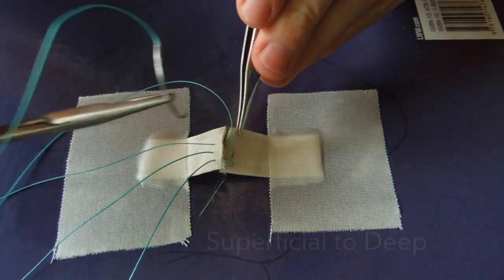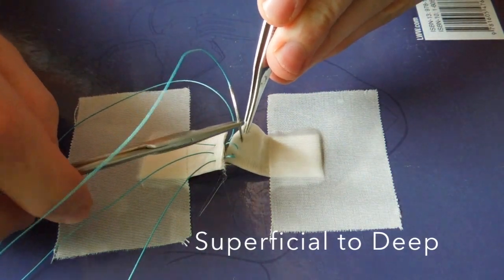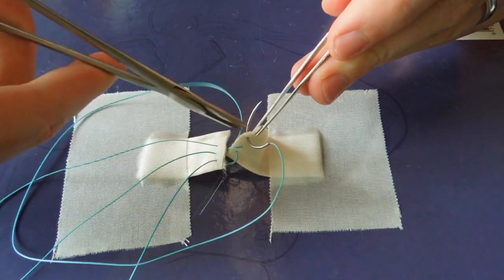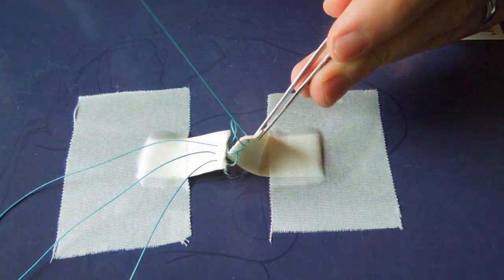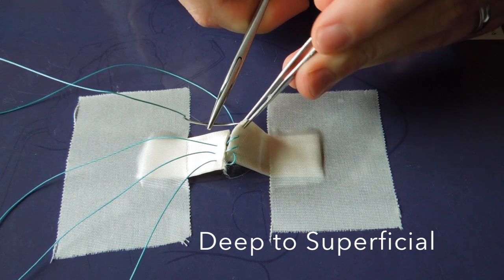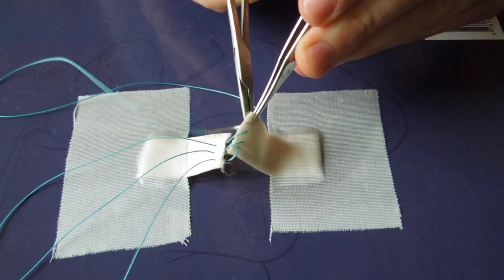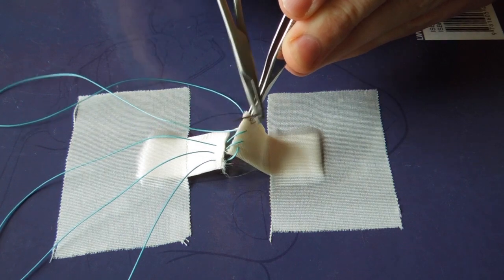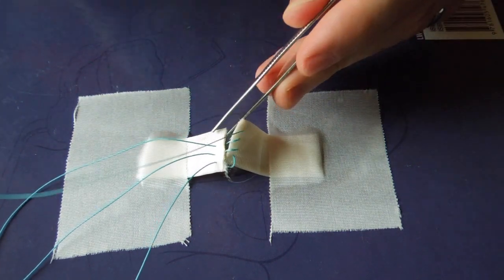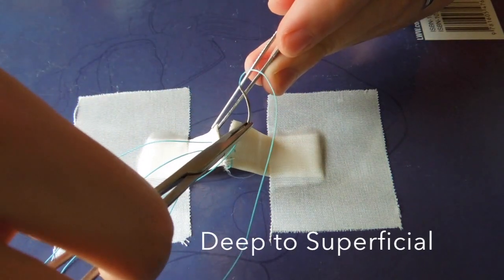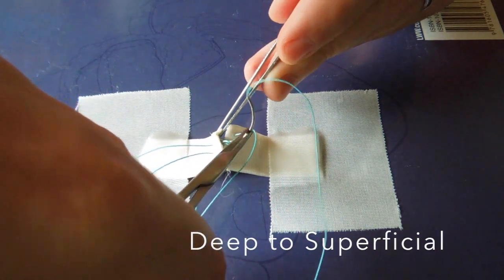Now if we're doing this repair for something like a plantar plate or an ATFL, when we throw these, if we tie the first throw, that will give us poor visualization for the second throws. So what we would do is we would throw each individual suture and then wait until the end so we can throw each stitch and then we would tie them all at the same time.